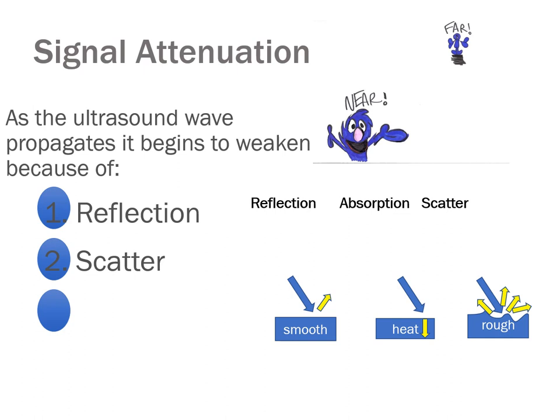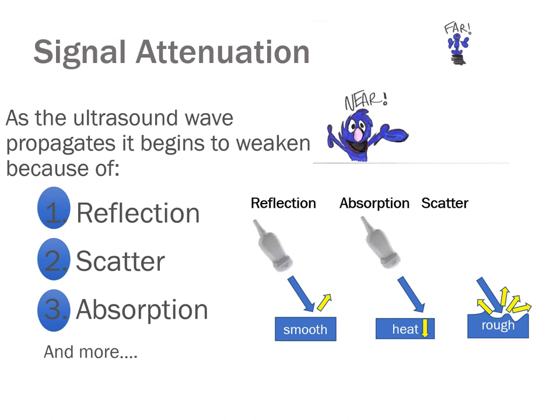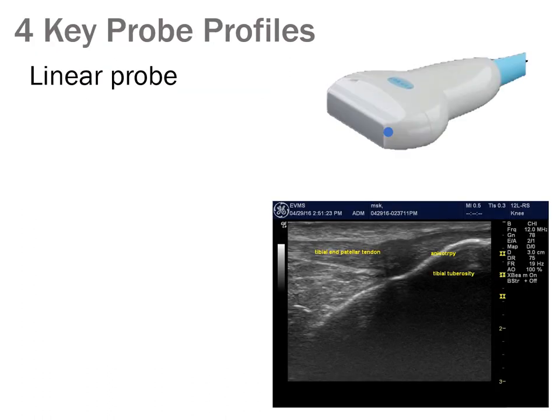Therefore, it will look like there's not as much coming back to the probe. Or it can absorb the sound as heat energy, which is what happens to things when there's a big impedance change, like between soft tissue and bone. And there are many other ways that signal can be attenuated, but basically there's less energy with time and less sound coming back to the probe shows up as attenuation.